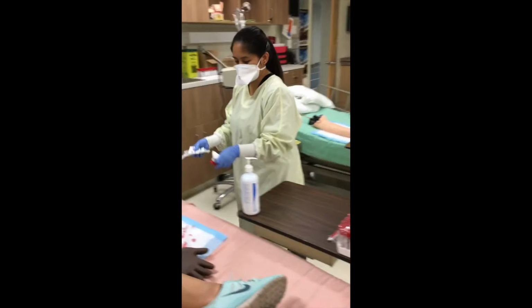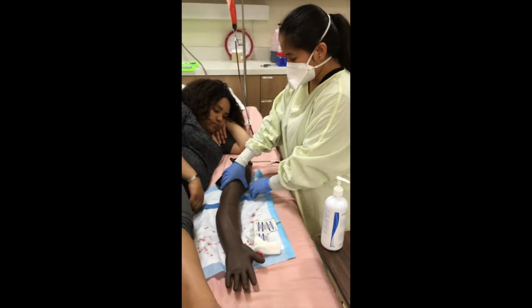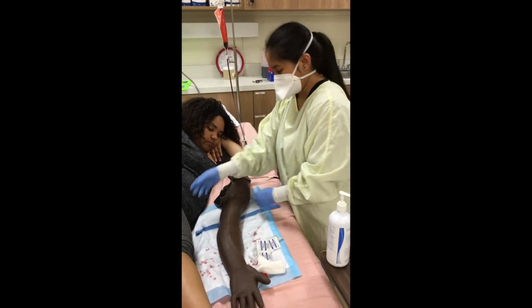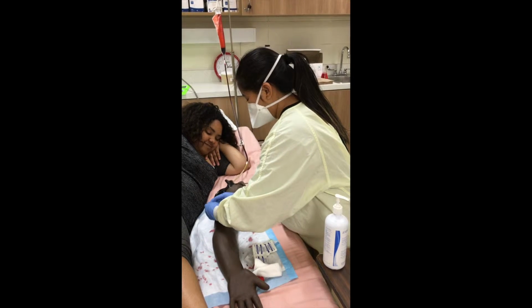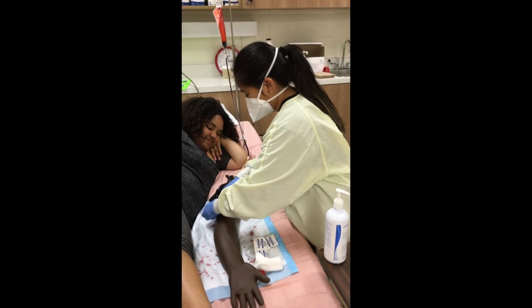So we'll just lay it all here. And we need a tourniquet to make sure the blood flows well. So we're just going to tie it into a type of knot that we could easily take off with one pull.